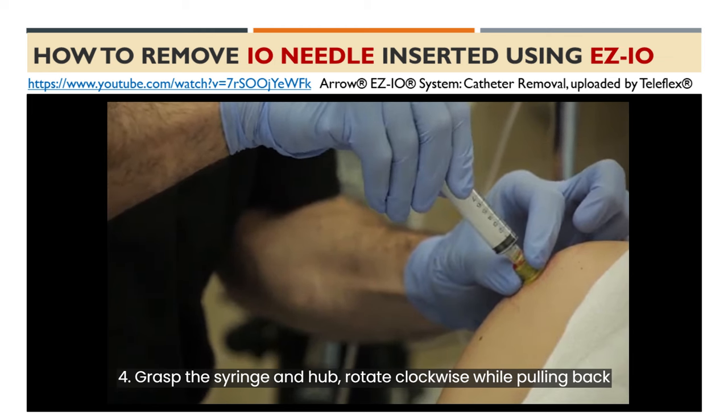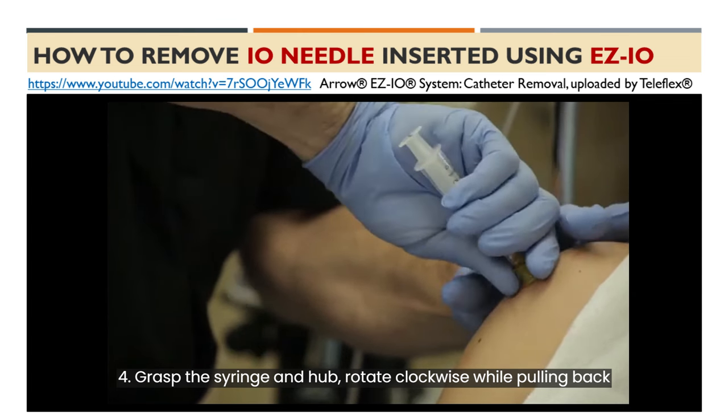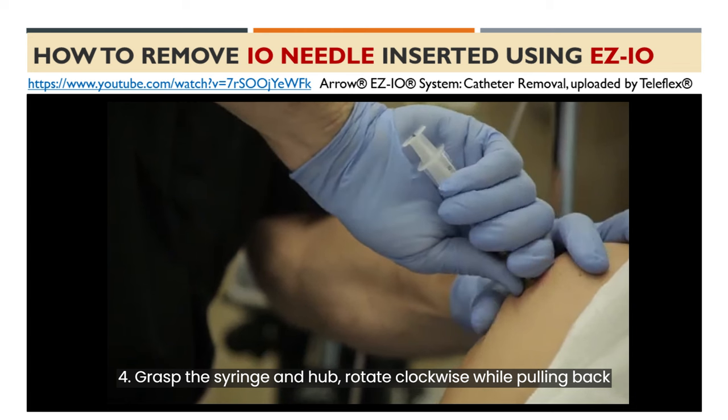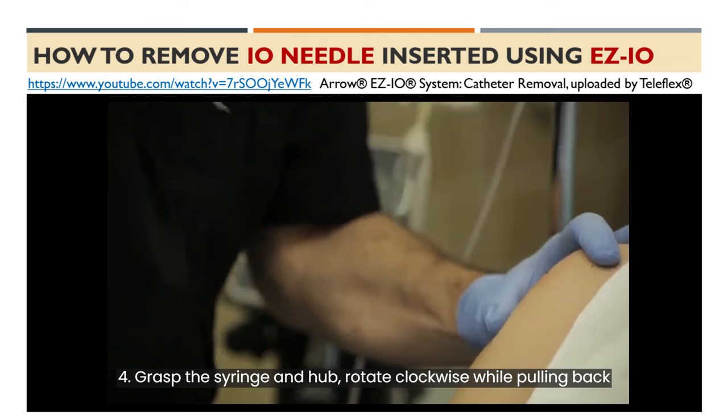Step 4: To remove the catheter, grasp the syringe and catheter hub and gently rotate the catheter clockwise while pulling straight back. Avoid rocking the catheter.